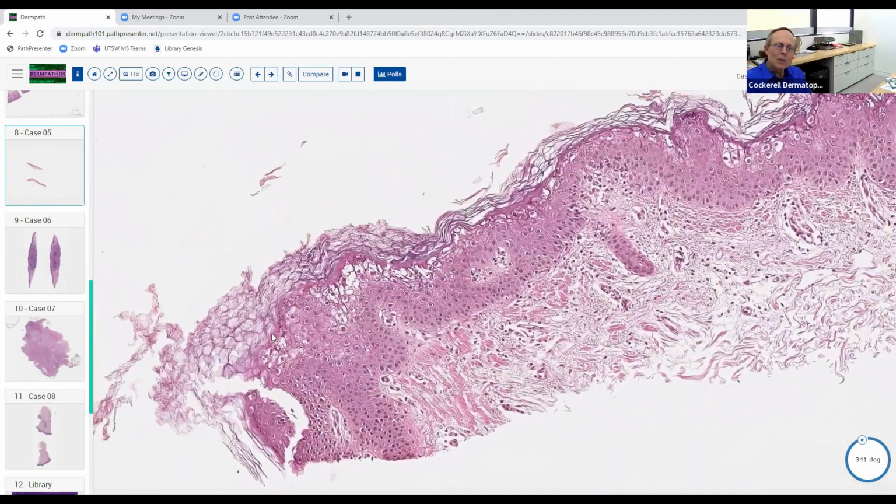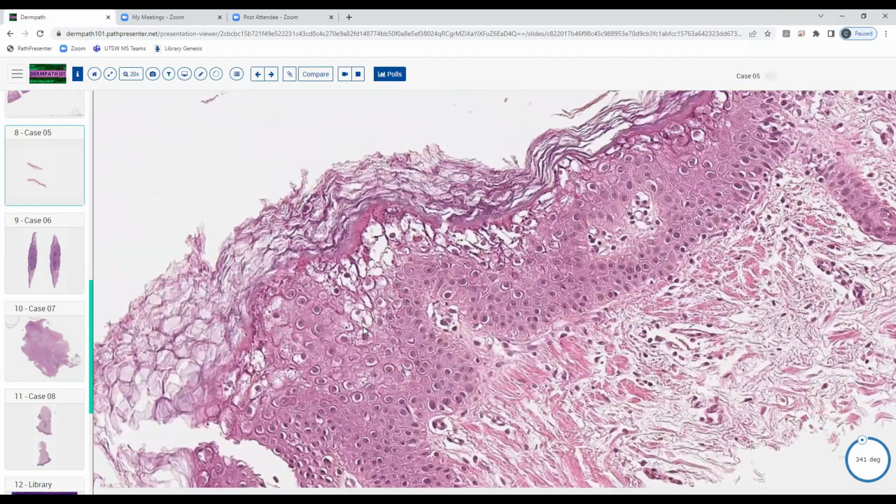Is that spongiosis? Or at least a lot of edema. Well, there's some pallor within these keratinocytes for sure, right? And then there's also this. What color are we looking at up here? Pink. So white, pink, and maybe if you look carefully, there are these almost little granules in there too that are kind of pinkish purple. And then you've got this abnormal cornified layer overlying it. It's basket weave, but it's not perfectly normal. It's also got kind of this darkish, basophilic, smudgy appearance to it.